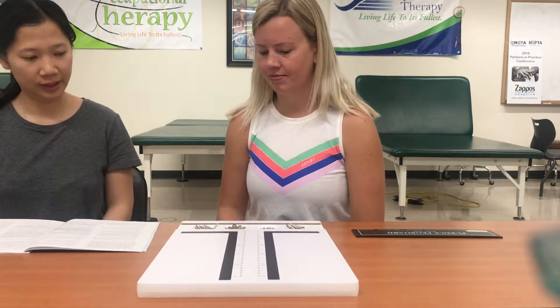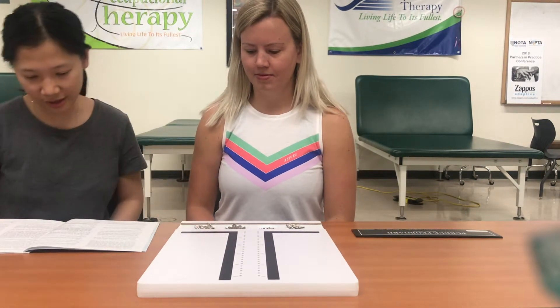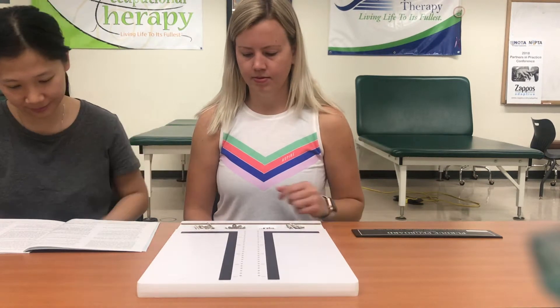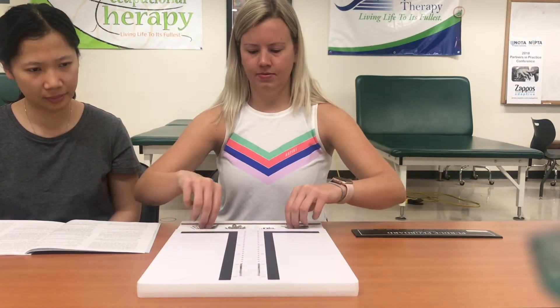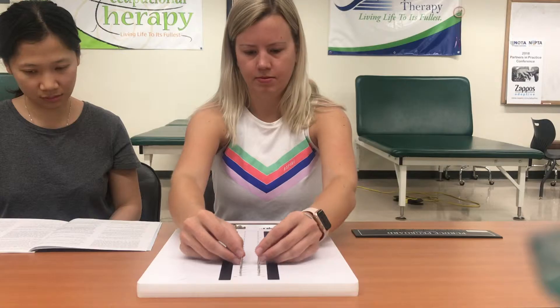For this part of the test, you will be using both of your hands at the same time. Pick up one pin from the right-hand cup with your right hand and at the same time pick up a pin from the left-hand cup with your left hand, and place the pins down on the rows. Now you may insert a few pins with both hands for practice. Stop. Take out the practice pins and put them back into the proper cups. When I say begin, place as many pins as you can with both hands, starting with the top hole of both rows, work as rapidly as you can until I say stop. Are you ready? Begin. Stop.